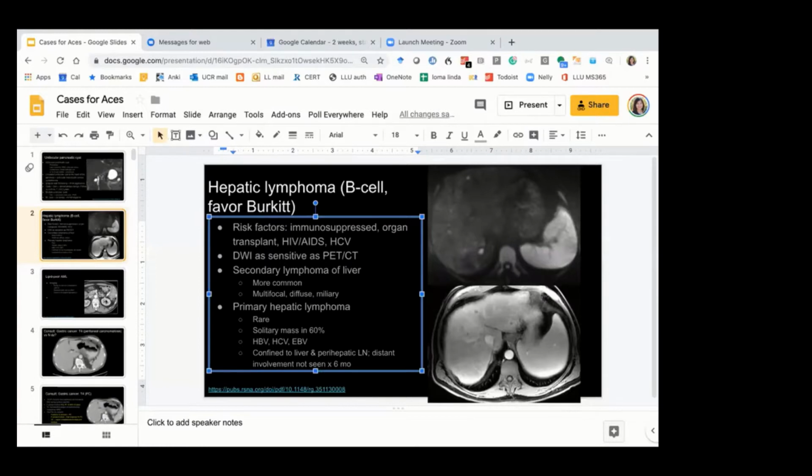Yeah. Every time I have lymphoma in the liver, we never called it that. The last time I saw stuff like that was in the spleen, and it turned out to be granulomatous disease, felt to be sarcoid, even though the patient didn't have sarcoid elsewhere. So they sneak up on you. Yeah. Whenever I see splenic lesions, I always just ignore it or call it benign.